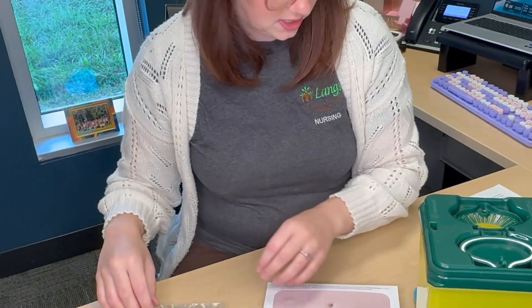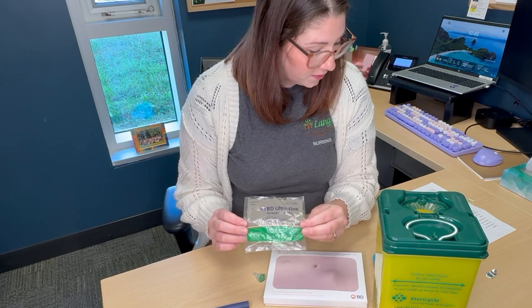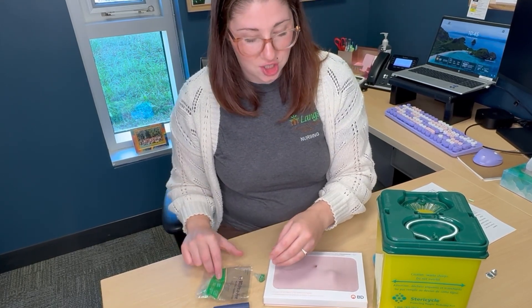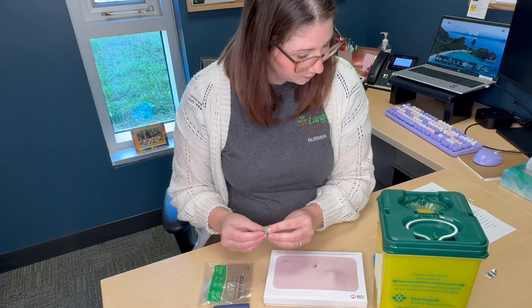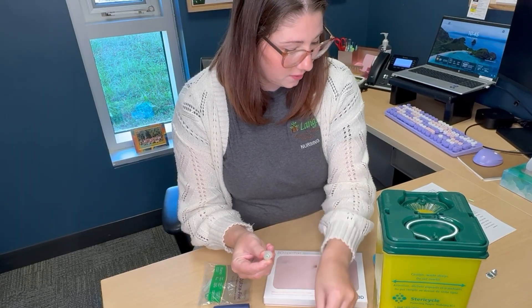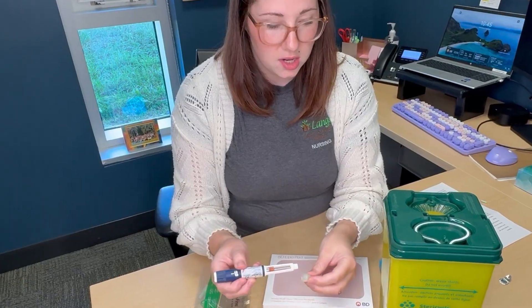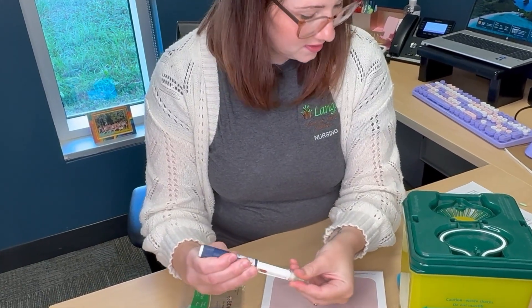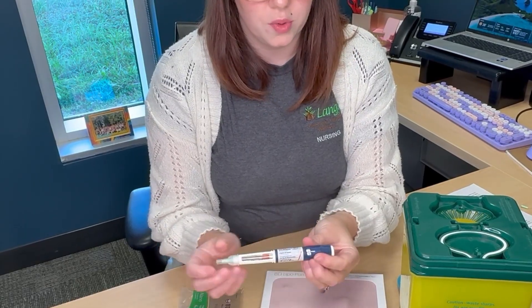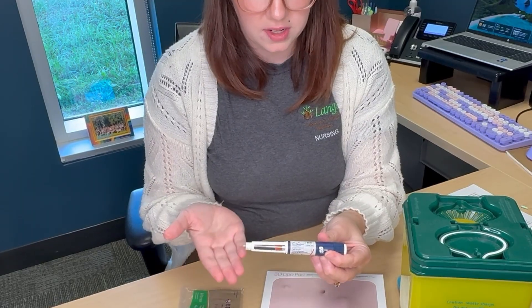You will have also received a box of needle tips with your prescription from the pharmacy. These needle tips will need to be attached in order to use your insulin pen. Take one needle and peel the paper off of the back, then attach the needle onto the pen until it feels tight and secure. Remove the two safety caps to reveal the needle underneath.